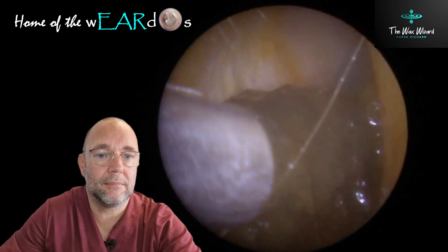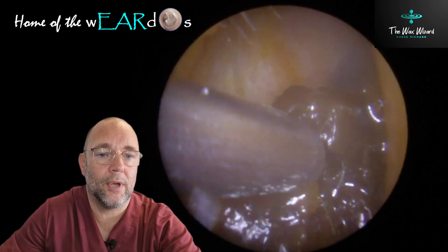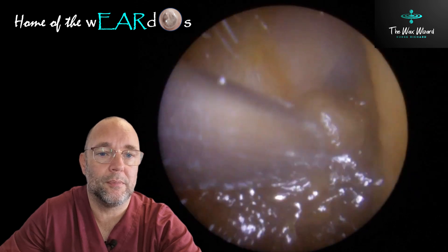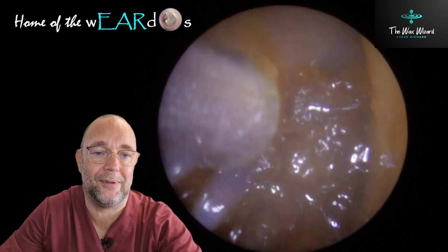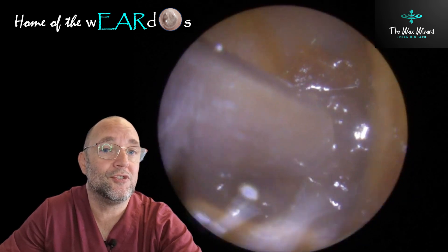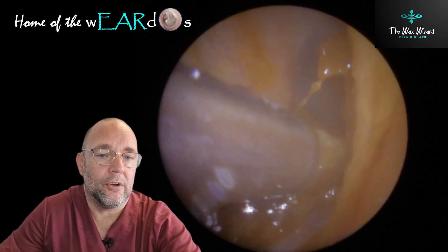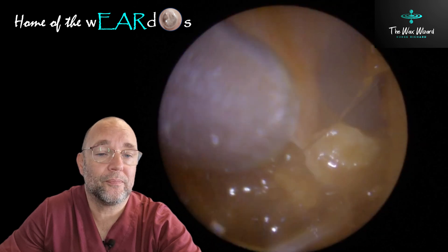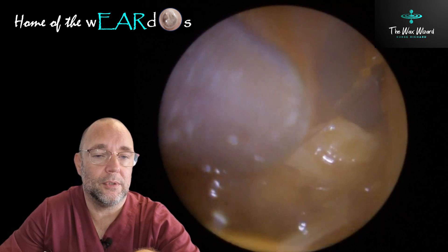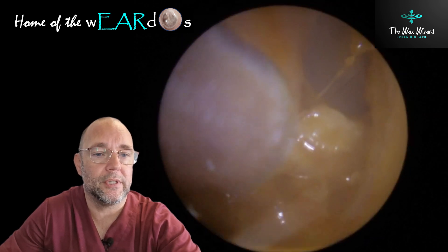Second one — it's like jelly, like earwax jelly. It's jellified. I used that word a while ago and wasn't even sure if it was a proper word, but somebody sent me a message confirming that jellified is indeed a proper word. So let's call this jellified earwax. It's not completely blocked — you can already see a little bit of the eardrum in the distance — but this stuff still needs to go. There's a little bit in the distance that we'll grab with the fine tube, because it's a bit nearer to the eardrum.